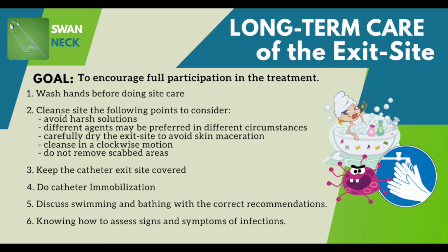Ensuring the exit site is carefully dried to avoid skin maceration, which could predispose the site to bacterial colonization. It is also important to do cleansing in a clockwise motion, starting closest to the catheter and working outwards. Do not remove scabbed areas, and keep the catheter exit site covered. Do catheter immobilization. From the moment the catheter is inserted, it should always be securely anchored to the patient's skin using tape or a commercially available immobilization device or tube holder.